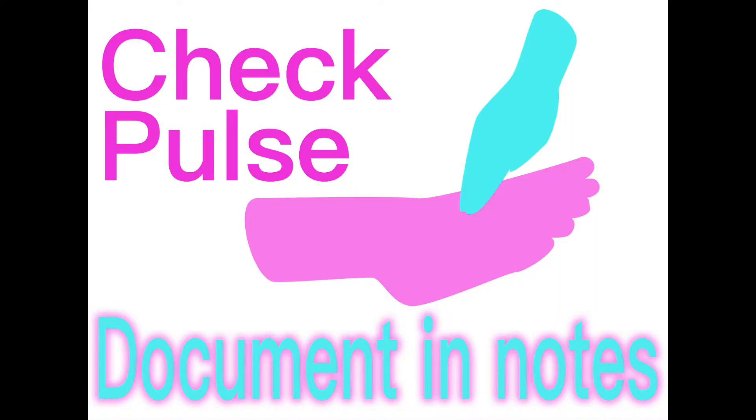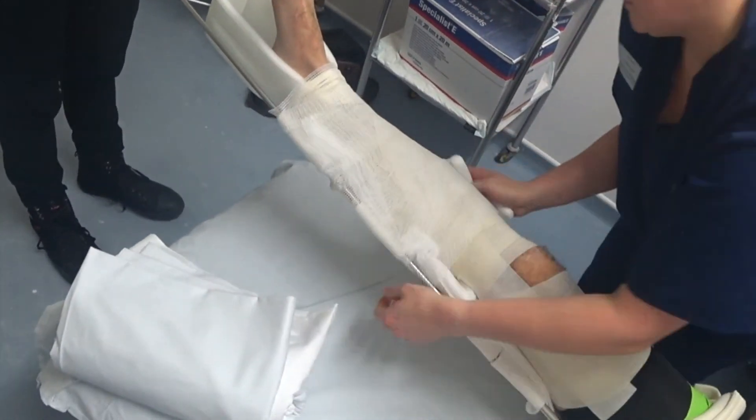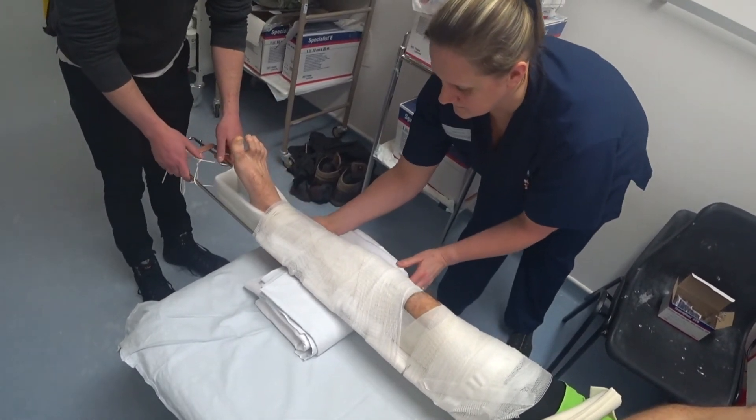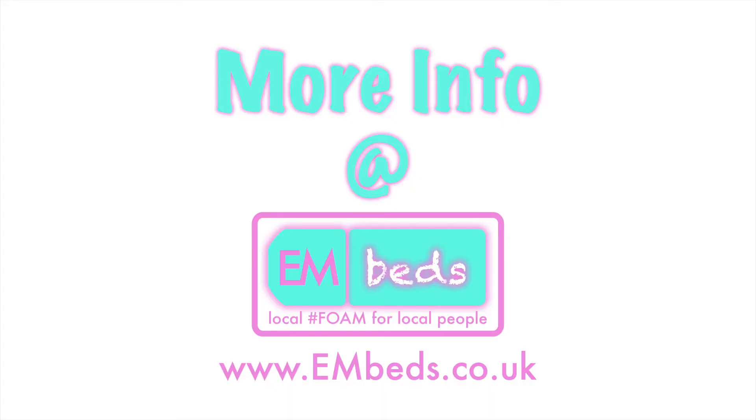Remember to check the pulses and sensation in the foot and document this in the patient's notes. Now the splint has been applied, the leg and splint can be bandaged together, remembering to elevate the leg with blankets or a pillow to prevent the patient developing pressure sores over the heel. Further information about applying Thomas splints can be found on embeds.co.uk.